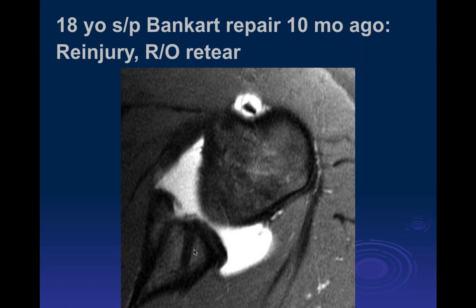An 18-year-old status post a Bankart repair 10 months ago. Re-injury, rule out a re-tear. On this axial PD fat-sat post-contrast imaging, we're seeing an irregularity of the anterior-inferior labrum. In fact, it looks to be displaced anteriorly. And it looks like there is some marrow signal within that labrum there. So I think this is an osseous Bankart repair, a re-tear.